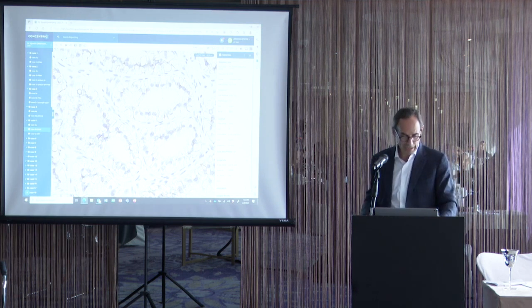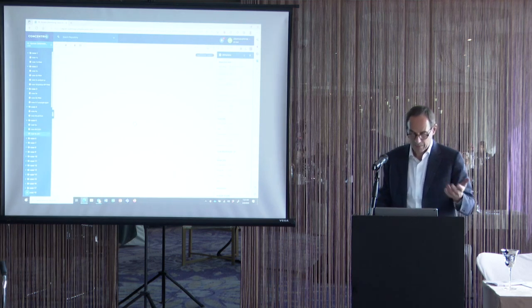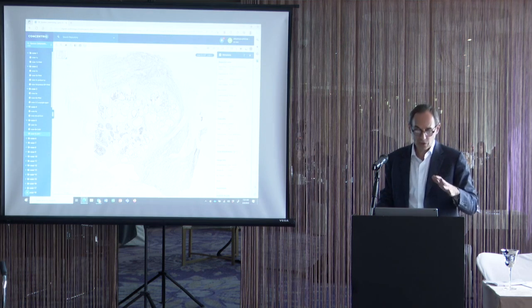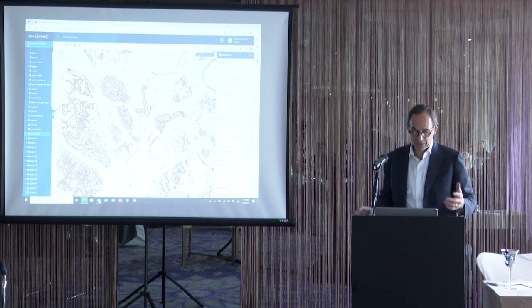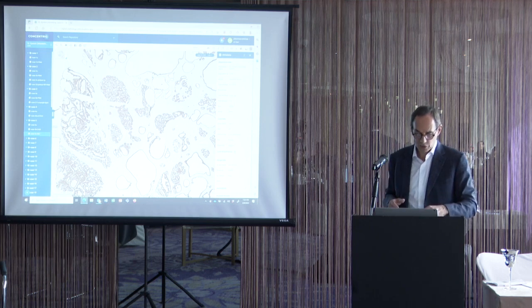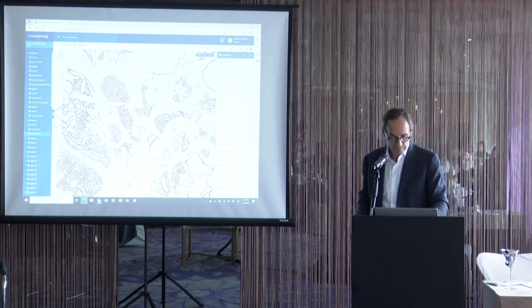So this is good staining, and then the other thing that you want to do is a CK7. As I mentioned, clear cell RCC can be CK7 positive, low-grade ones, but never diffuse CK7. So if you see a clear cell lesion with diffuse CK7 like this, that's not clear cell renal cell carcinoma. You should be thinking clear cell papillary renal tumor, which is a benign entity.